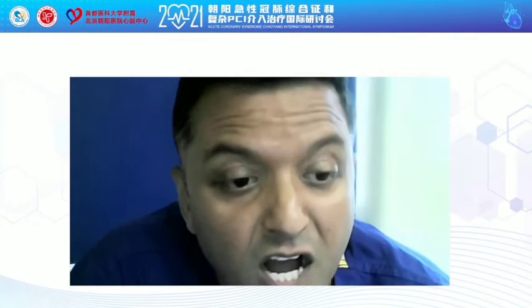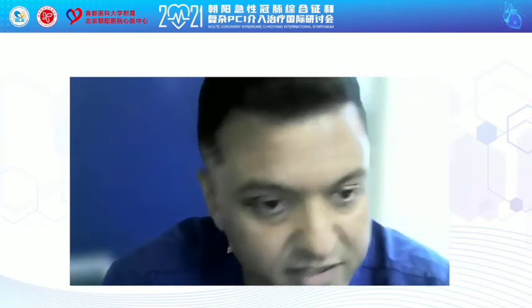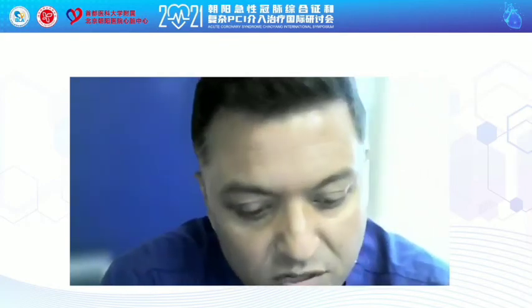In this case, I did it purely because normally with CTOs, you often have good retrograde options or at least retrograde imaging. So you can set up with two catheters so that you can confirm your wire position by taking contralateral injections. Now, in this case, this gentleman's right coronary, when you take the angiograms, doesn't show anything in the circumflex system, despite prolonged imaging. The only way you see the distal circumflex is via the LAD injection. So there was no real option of doing that, particularly once you've crossed the lesion and taken out any anterograde flow at all. The only way of being sure of your true lumen safety here was a distal tip injection.